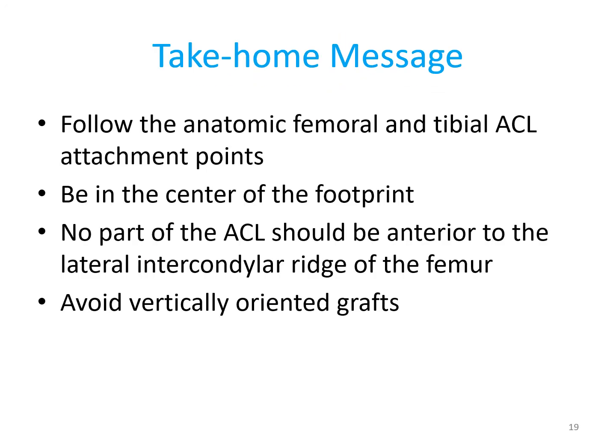So the take-home message is follow the anatomic femoral and tibial ACL attachment points. Be in the center of the footprint. No part of the ACL should be anterior to the lateral intercondylar ridge of the femur, and avoid vertically oriented grafts by doing a transportal and not a transtibial femoral drilling.